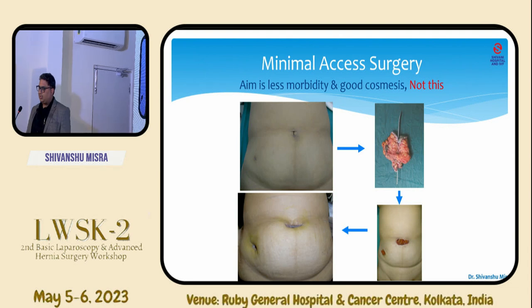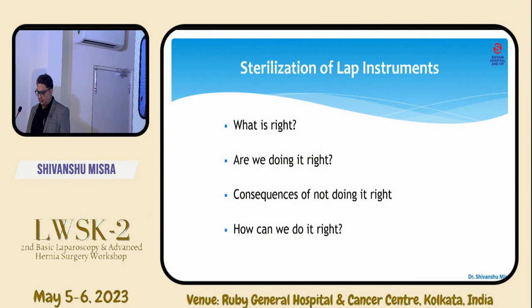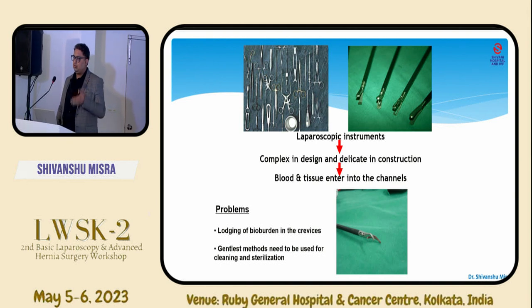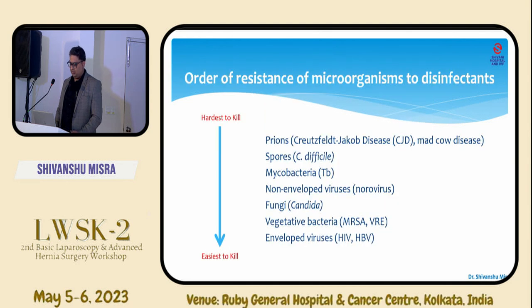So minimal access surgery is much more than cosmesis. It's about safety and sterility, of course, and for that, sterilization of the laparoscopic instrument is of utmost importance. So how do we do it right? Laparoscopic instruments, as compared to open instruments, have different crevices. Blood and tissues enter through capillary action, and there is lodging of some bioburden. So we have to properly clean it first. What is important before sterilization is the proper physical cleaning of the instruments.